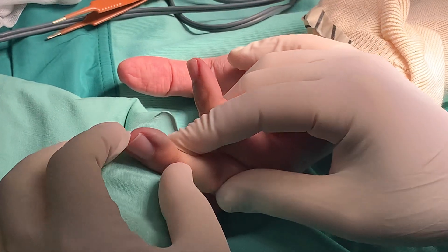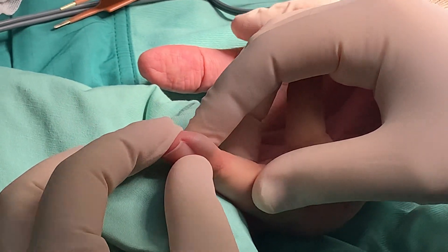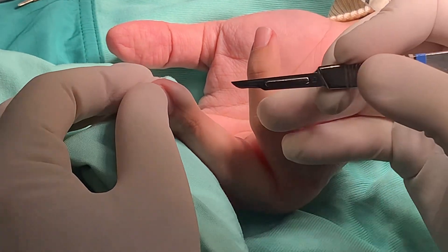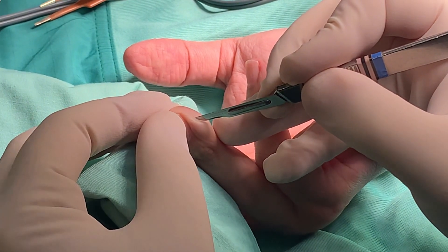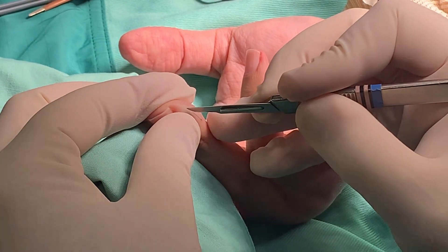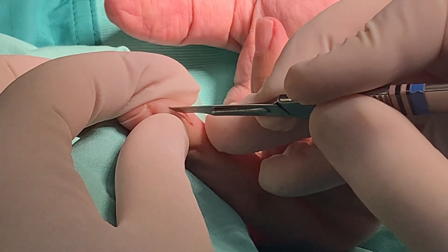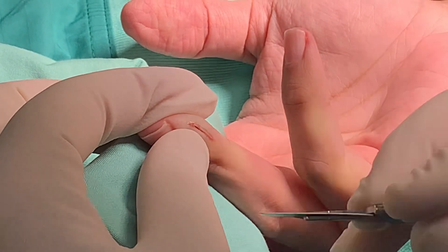Ladies and gentlemen, you can see a finger with a blue hue in this area. You will see an arteriovenous malformation right here — it has a blue hue. We will cut it open with a very gentle move, cutting the skin open very gently, trying not to puncture this arteriovenous malformation.